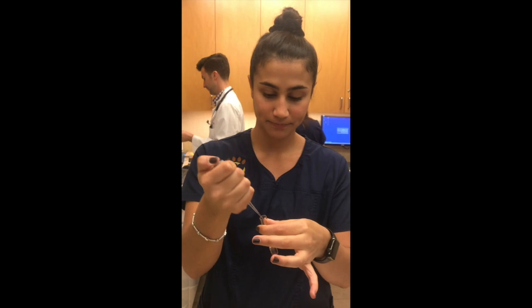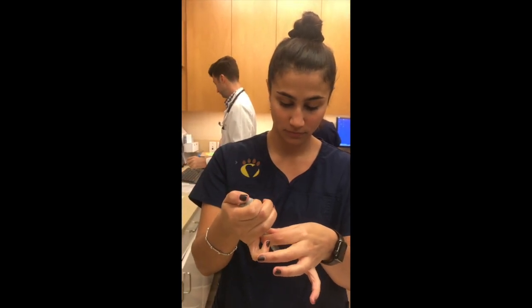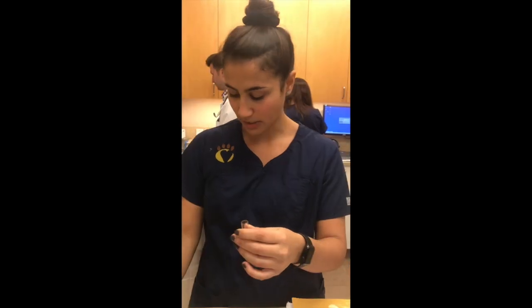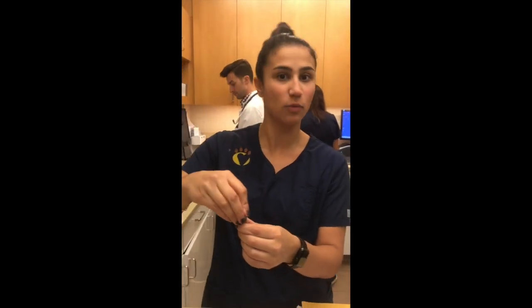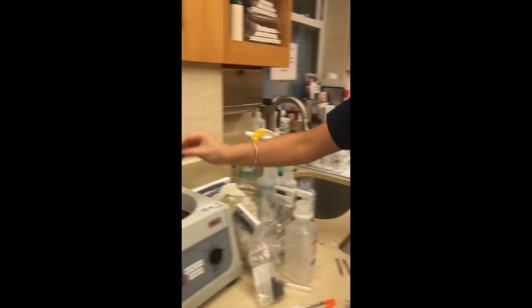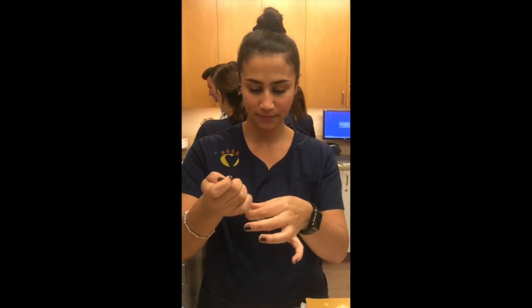Here's our recipient tube after it's been centrifuged for the second time, and I'm just gonna decant the plasma. I'm gonna centrifuge it for the 3rd time for 1 minute with our donor tube as well. Okay, so after being centrifuged for a 3rd time, I have our recipient tube here. So first I'm just gonna decant the rest of the supernatant.